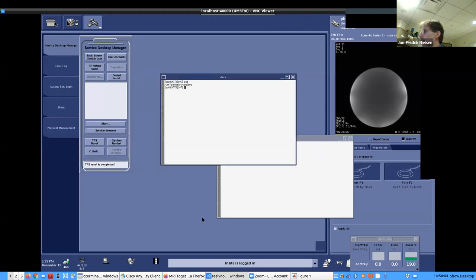So we are in user G research Pulseq, and there's a file here called topb30.entry. Because CV1 equals 30, this is the entry point for the interpreter. It's going to look in the folder that's listed on the first line, and that's where it's going to find these scan files. So we created a folder called EPI. Let's go to that. Now we're in this folder, and I already downloaded those files earlier.